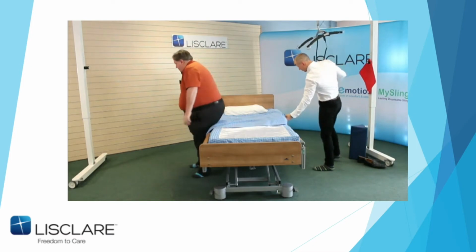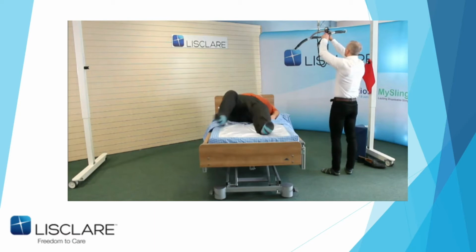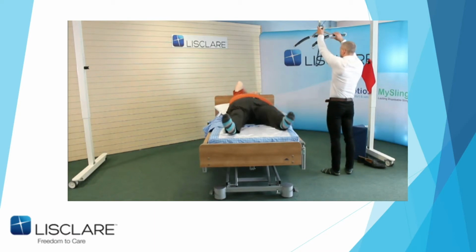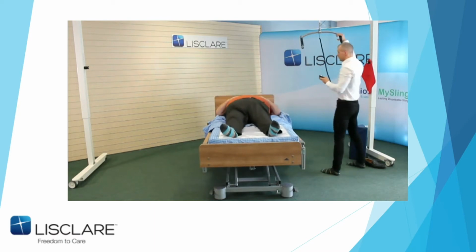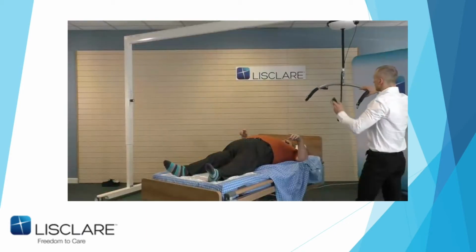Now, you may hear me talking, obviously, to John. I get the light down. Now, obviously, this isn't the 120 wide bed. And normally a patient of my size would be on a 120, but this saved me chopping it around, and it actually makes it more challenging for John.